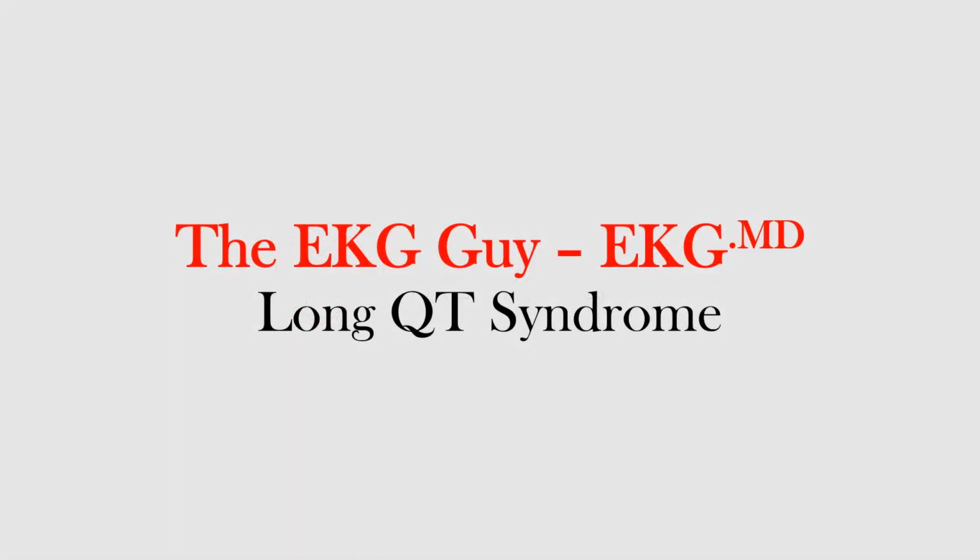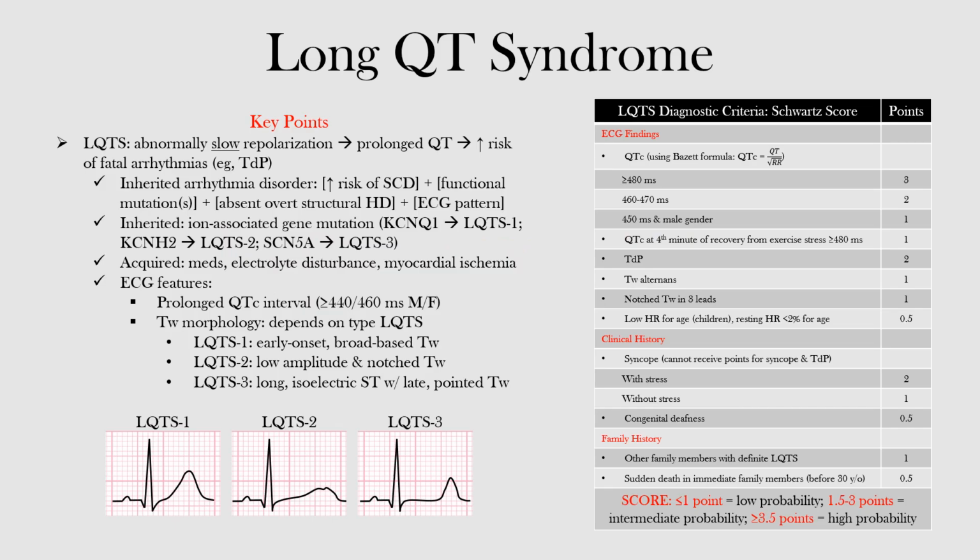In this lecture, we will discuss long QT syndrome, including its pathophysiology, 3 different types and their respective EKG features, as well as diagnostic criteria. Subtle differences in QRS, ST, and T-wave morphologies generally represent benign variations. However, in some cases, these changes may be diagnostic clues to identify rare inherited disorders that are associated with an increased risk of sudden cardiac death.